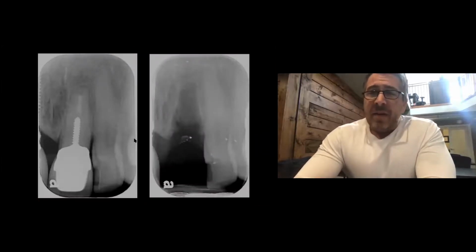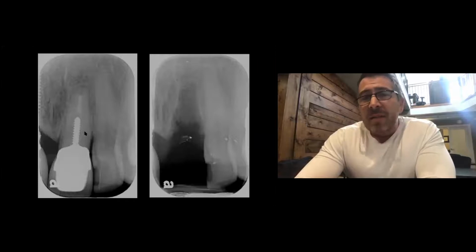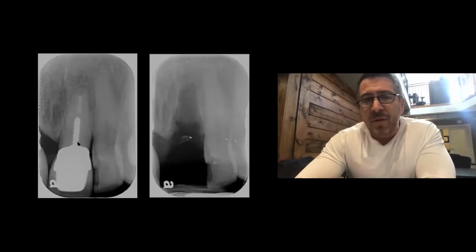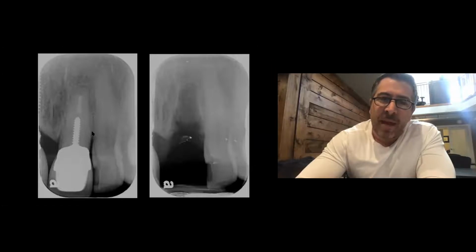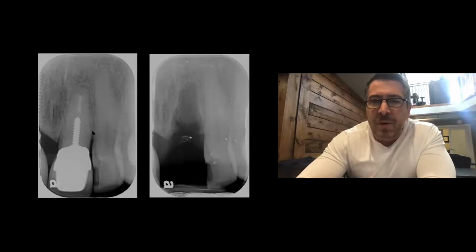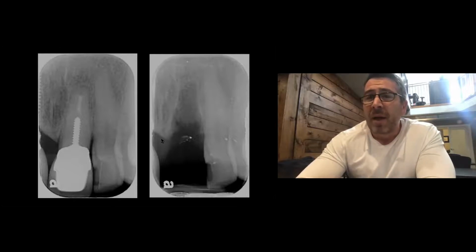When you start looking at interdental height of bone, you start removing teeth, look at things like root proximity. There's an implant on the 1-1, patient lost the 2-1 crown post, tooth is non-restorable, is going to have the tooth removed. You look at the proximity of these two teeth. So that little bit of bone there, yes, if the patient has papilla to begin with, when I take that tooth out, may I lose a little bit of bone here? I might. So I have to tell that patient in advance that just looking at that there's a good possibility of losing 1 millimeter or 2 of bone here, and we might have a problem with the papilla after that tooth is removed on the final restoration.